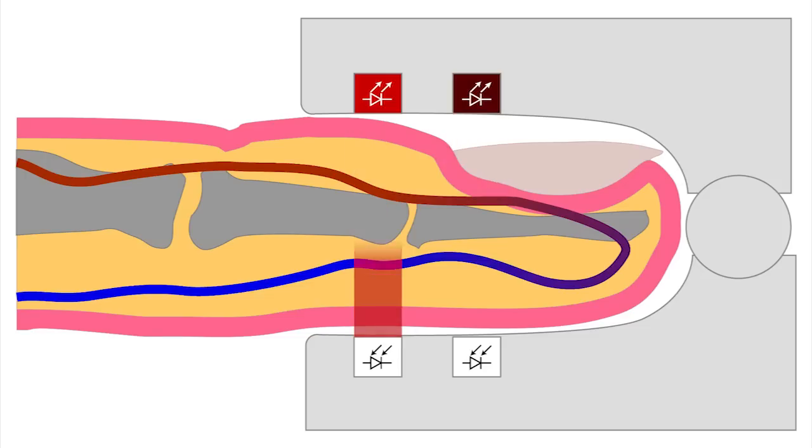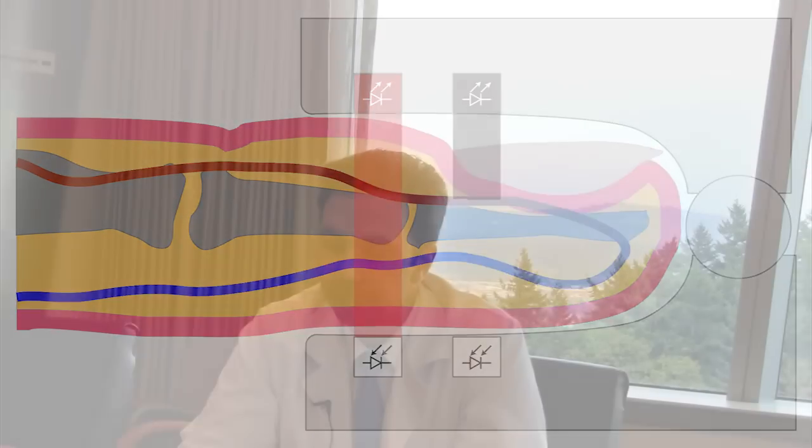So if our pulse oximeter sends light of both of these wavelengths through a piece of tissue, that is both 660 nanometers and 940 nanometers, and we only see light come through the other side of that tissue at 660 nanometers, then we know that all the light from that 940 nanometers was absorbed as it was going across that tissue. Now, what that tells us is it was probably absorbed because there was a high concentration of oxygenated hemoglobin present to absorb that particular spectrum of light.